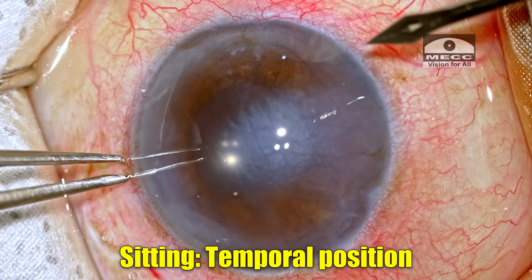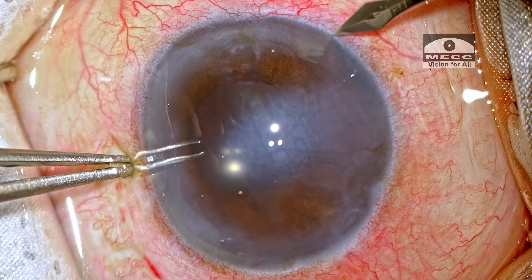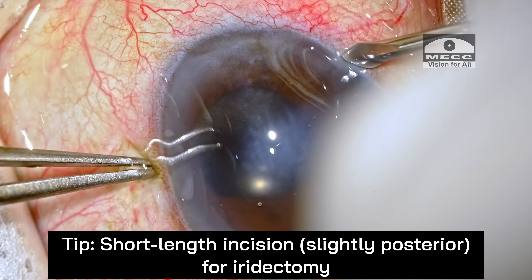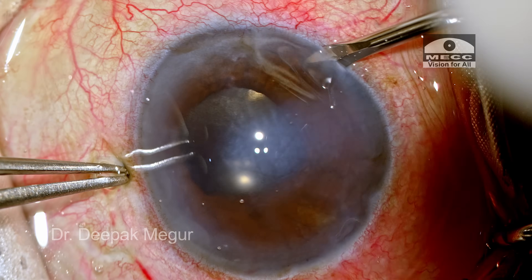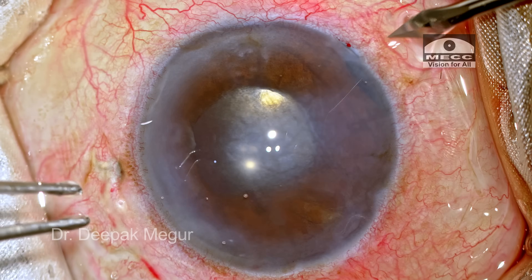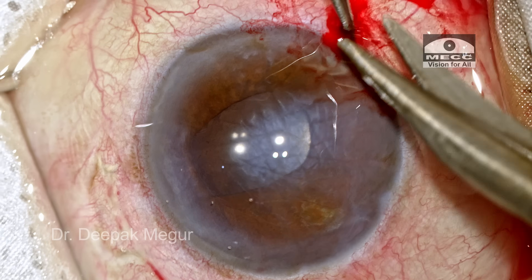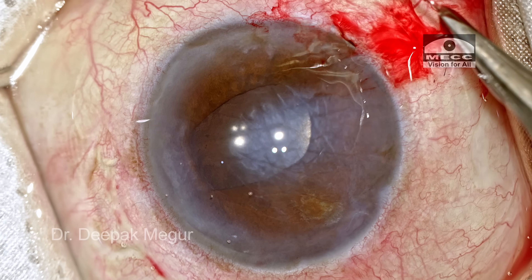I'm sitting temporally and this would be around 5 o'clock. The trick to get the incision for iridectomy is that it has to be a very short incision and slightly posterior — this is critical. If you have a very long incision, it's very difficult to go and catch the base or root of the iris. The incision is done now. I'm using forceps to pull the iris out and then the iridectomy is done.